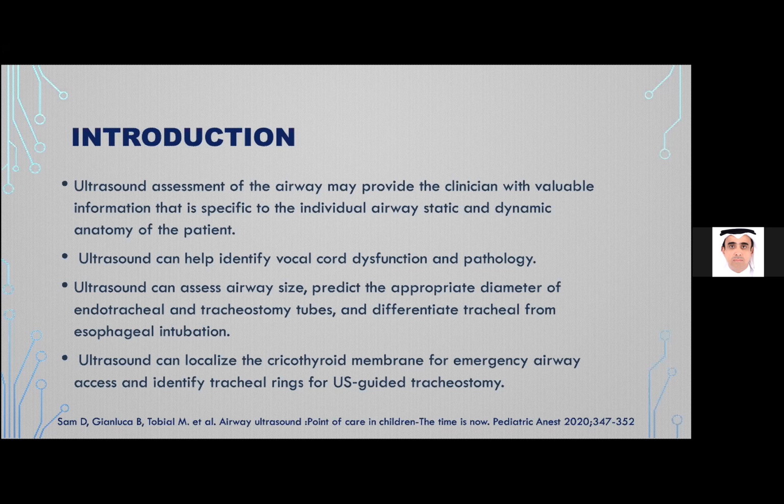Ultrasound can help identify vocal cord dysfunction also, and whether there is any abnormality, pathology or congenital anomaly, as mentioned by Dr. Faiz, Dr. Maher and Dr. Saleh about the normal anatomy and how to differentiate or predict if there is abnormality in the vocal cord, so you are ready for that problem and predict it before you face it during the intubation.